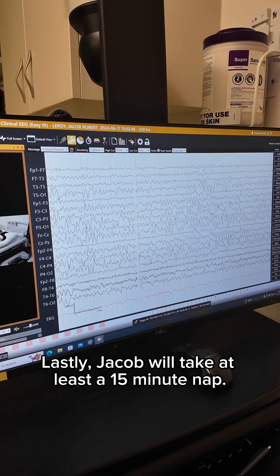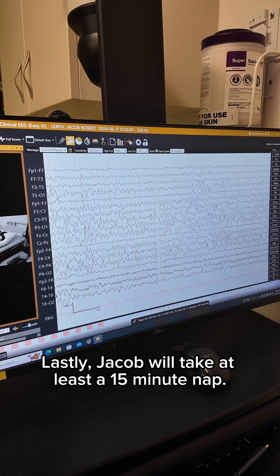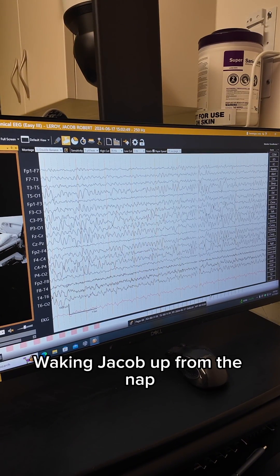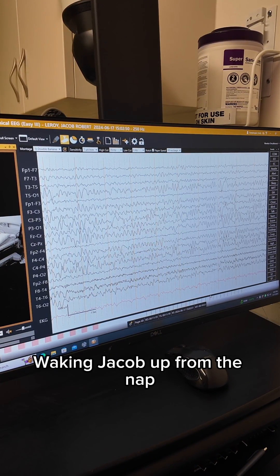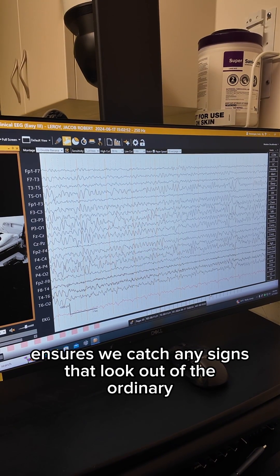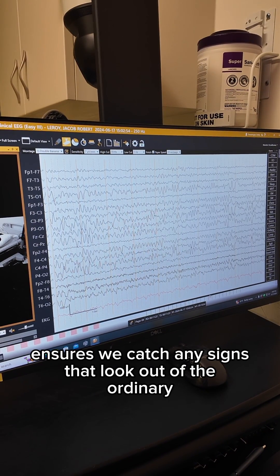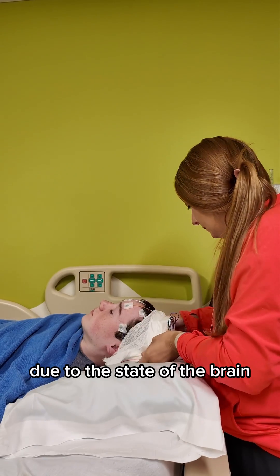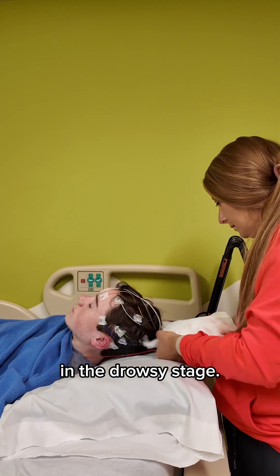Lastly, Jacob will take at least a 15-minute nap. Waking Jacob up from the nap ensures we catch any signs that look out of the ordinary due to the state of the brain in the drowsy stage.